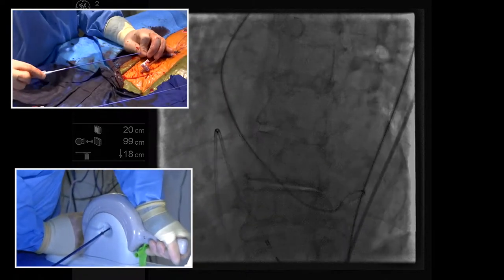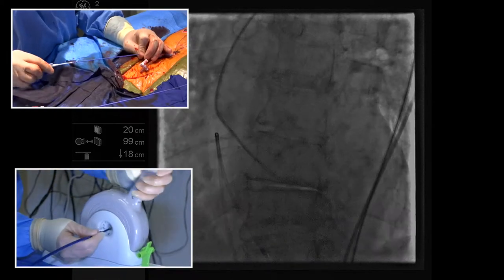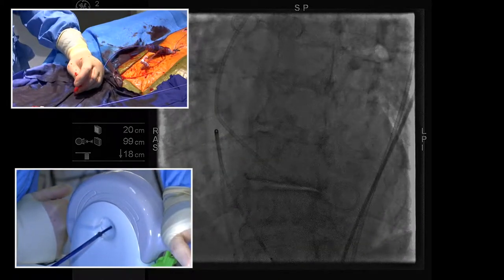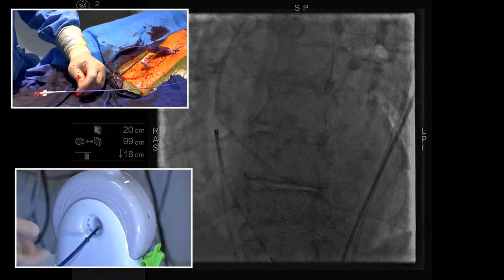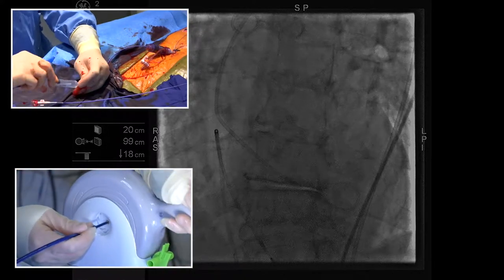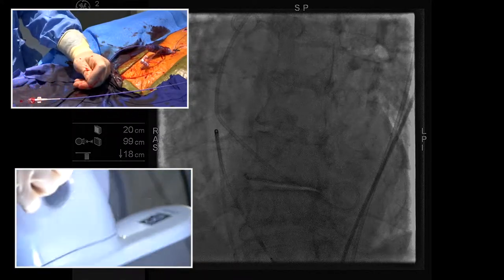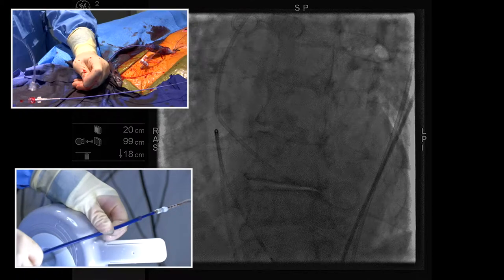That's an easy one to try to figure out what the difference is and why doctors like that one better. All right, so the pigtail's in. The next thing we're going to do is get some pressure measurements. You guys probably have read about how aortic stenosis works, and there's a pressure gradient across the valve, and we're going to show you that right now.